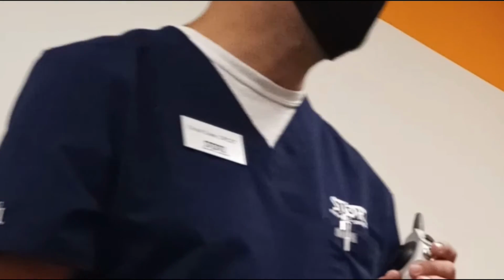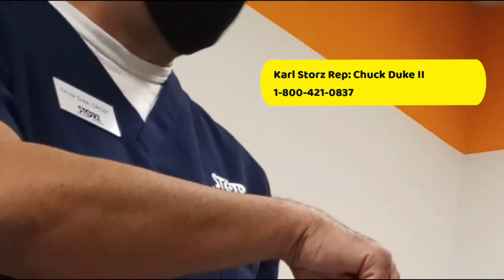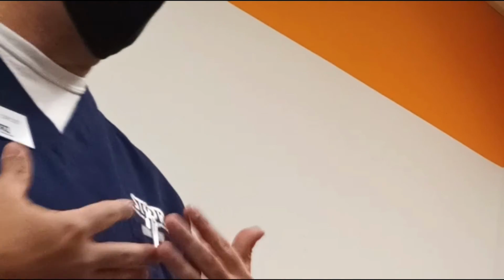We recommend at least a minimal of 100 milliliters of fluid to be flushed through the scope, and also to be drawn up through the scope. So you have to do this as well as the scope buddy? No, if you're just using the scope buddy, you don't need this step. So I'm just going off of what our IFU says right now.